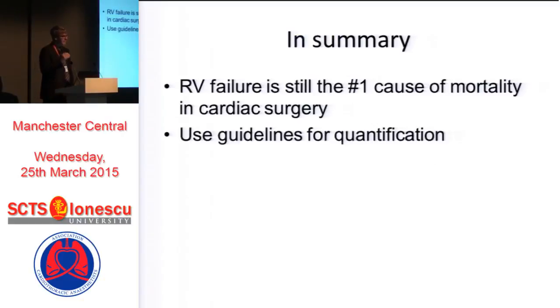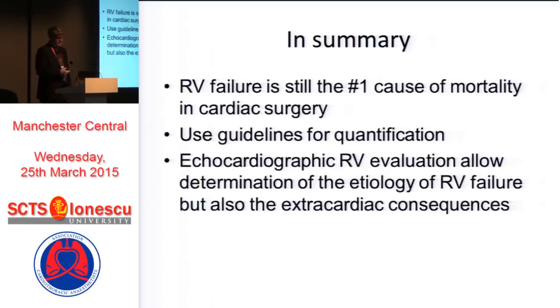So in summary, right ventricular failure is still the number one cause of mortality in cardiac surgery. There are guidelines used to quantify right ventricular function. The role of echocardiography is to determine not only the function and the dimension, but also the etiology and the extracardiac consequences.